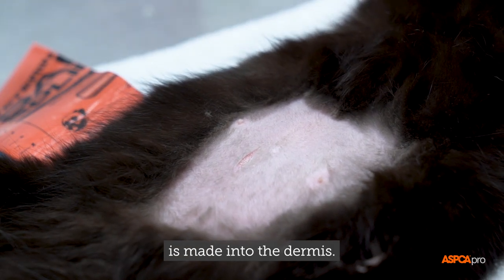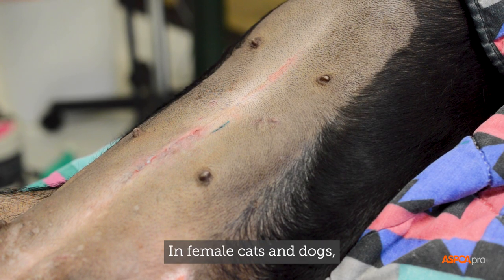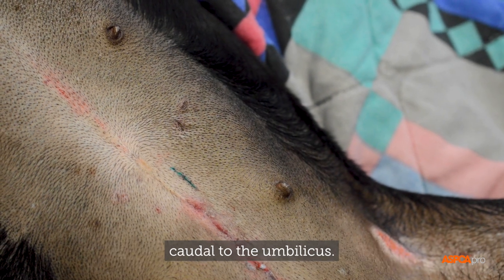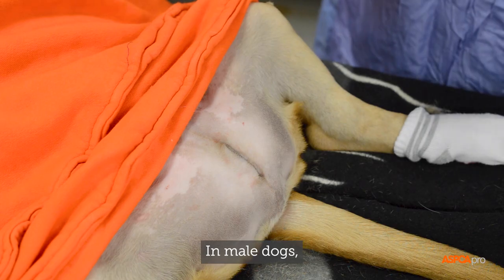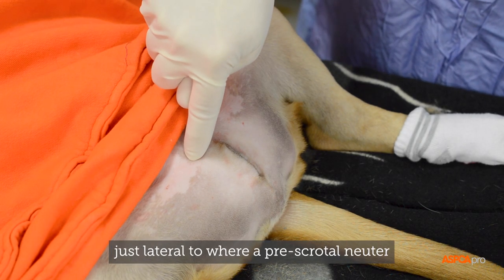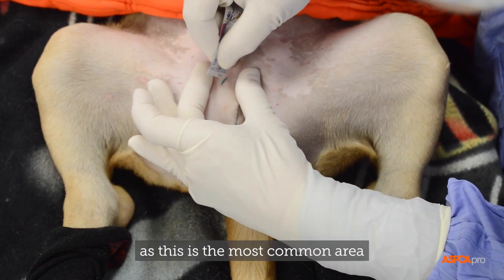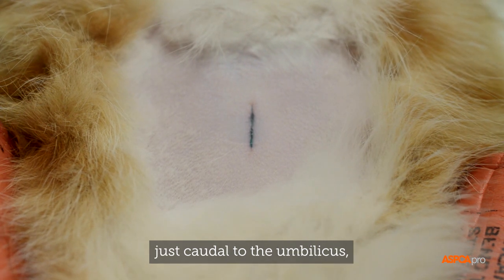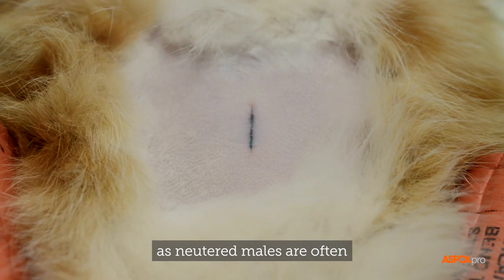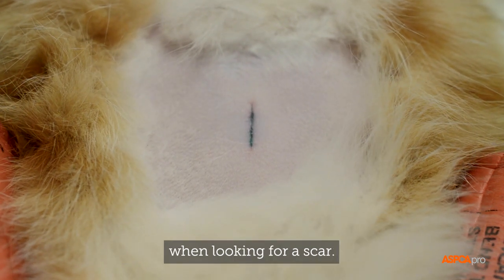In female cats and dogs, the tattoo should be placed just off midline, caudal to the umbilicus. In male dogs, the tattoo should be made just lateral to where a pre-scrotal neuter incision would be placed, as this is the most common area shaved when looking for a scar. In male cats, the tattoo is placed just caudal to the umbilicus, as neutered males are often mistakenly thought to be female, and this is the most common area shaved when looking for a scar.